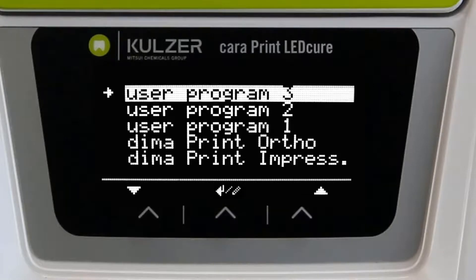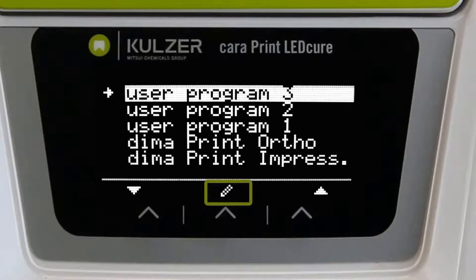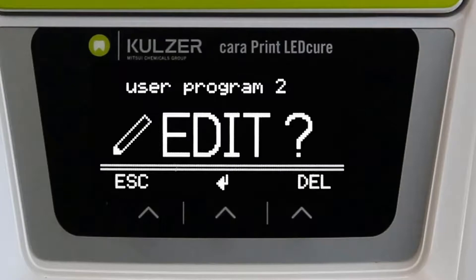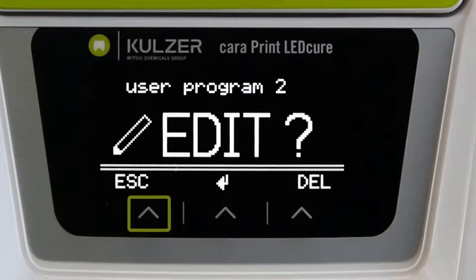Pressing for at least one and a half seconds activates the program and allows the parameters to be changed. If a customized program has not yet been individualized, you will only find the pen above the middle button and can enter the programming of the program directly by pressing the middle button. If you have accidentally entered the programming function, you can return to the overview at any time by pressing escape, the left button.